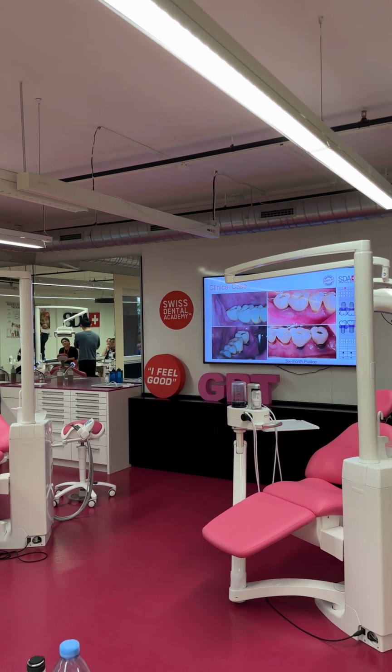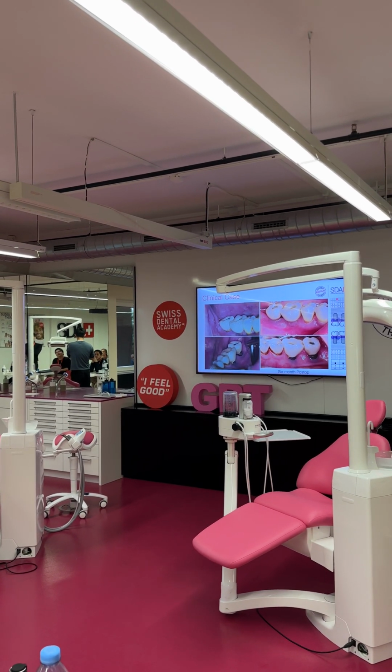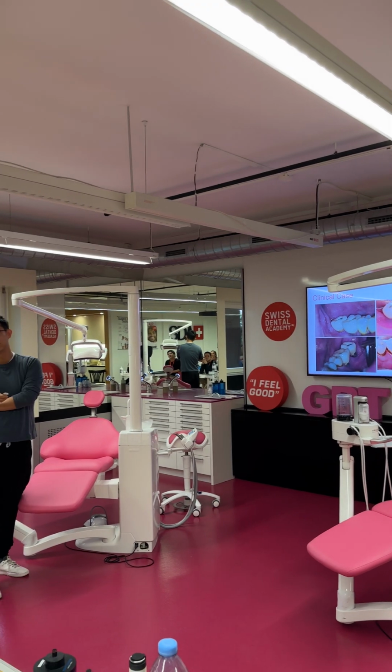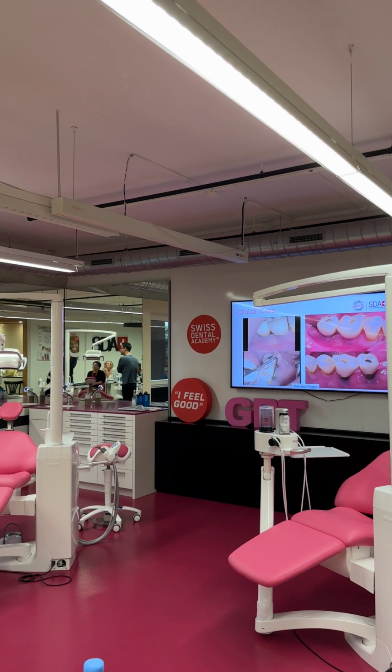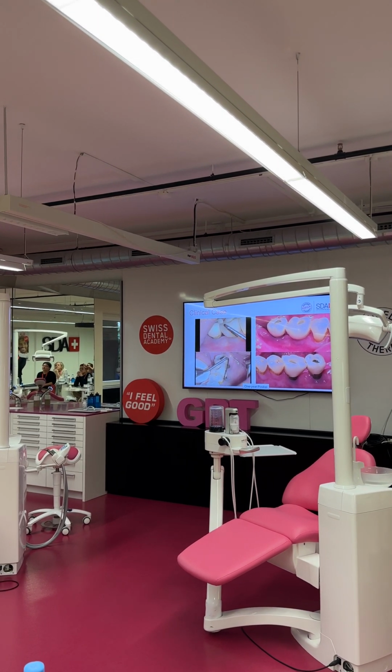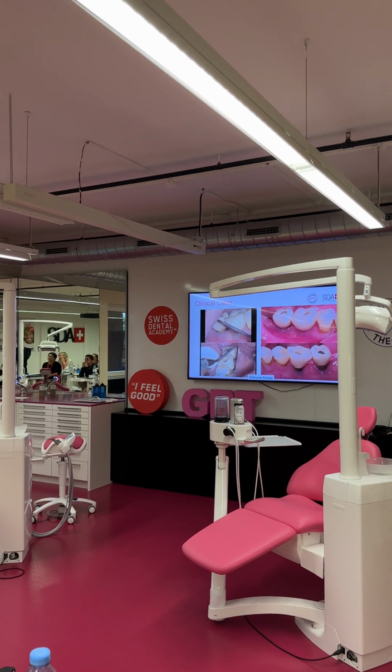You see these implants, they are moderately roughened surface. No matter how optimal your oral hygiene is, they still tend to trap bacteria really readily. And let's take a look at 1 year post-op. Clinically, it doesn't look too bad. I didn't even bother to put in my perio charting because this is the best chart you can see, right? I probe quite hard, you see, I can see the flinching.